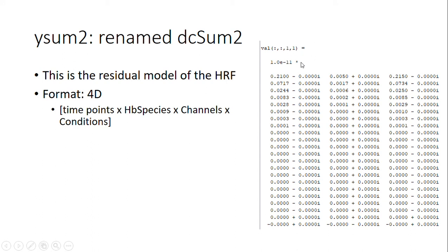Again, you'll run through all the conditions, and then click up 1 on channels, run through all the conditions, click up 1 on channels, and you'll go through as your data set goes through. And also keep in mind you do have your real and imaginary aspects of each of these.